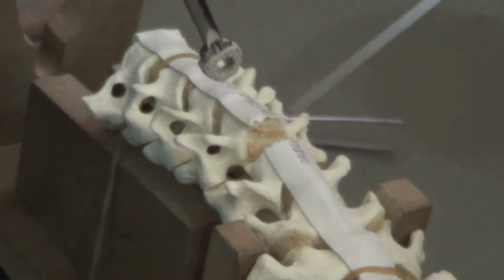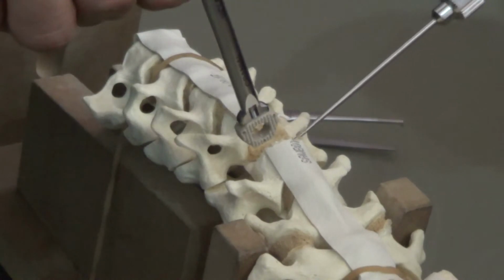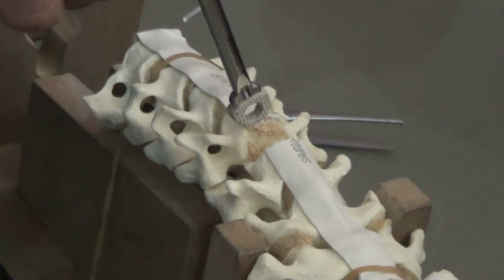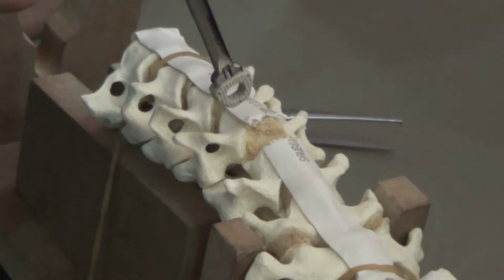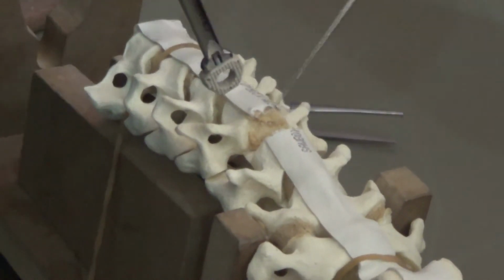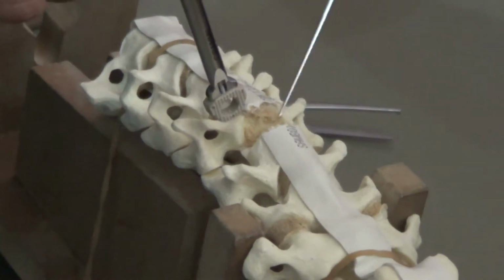And in the cervical region, there is a very small amount of epidural fat. You will get a lot of fat in the lower thoracic, upper lumbar region, but here there is very minimal fat. So when you are going from front to behind, you should be very, very careful.